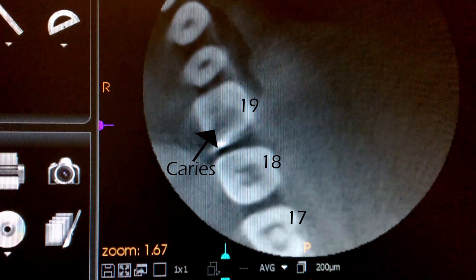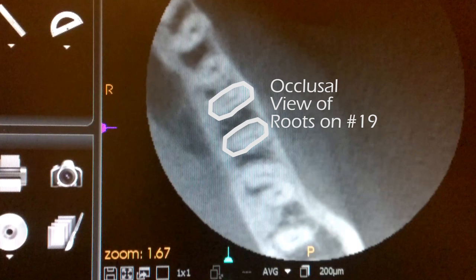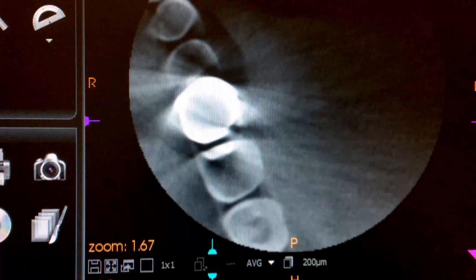The cone beam works in such a way that it takes sliced images and turns them into 3D images. One cool thing about a cone beam is that you can see it from the occlusal down.